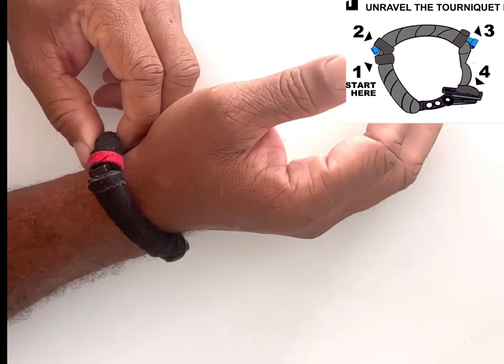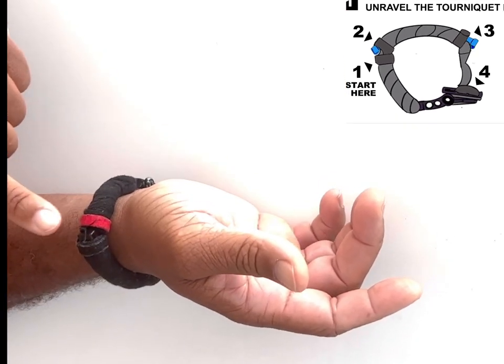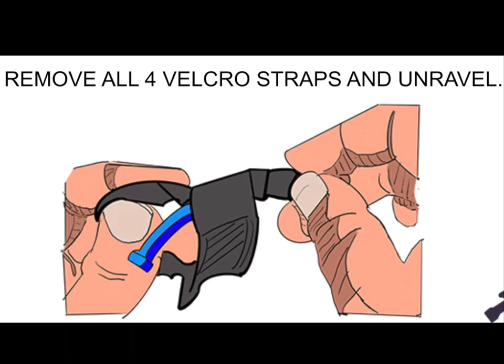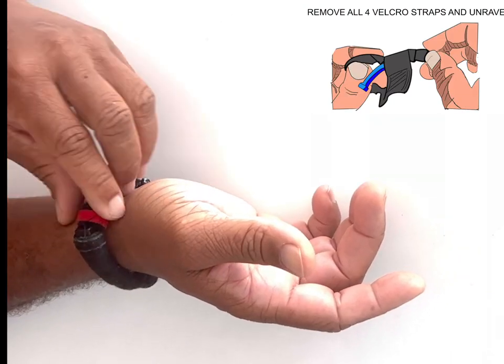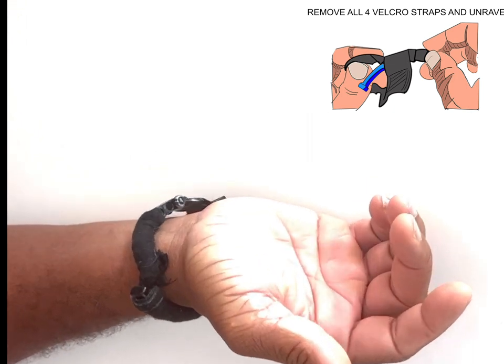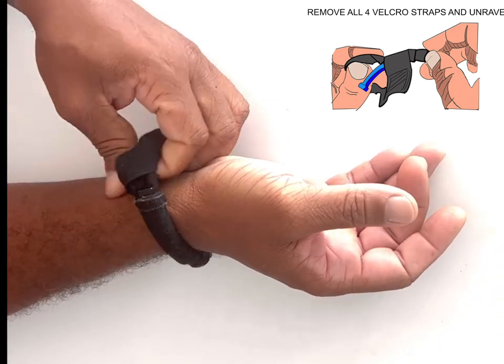Prepare it to be a tourniquet — right now it is a bracelet, just a bracelet. The first step is to get it off your arm. This red one says 'take me off first,' so you just take the velcro off. You can just pull it off and it'll come right off.